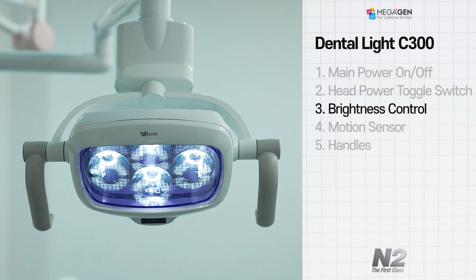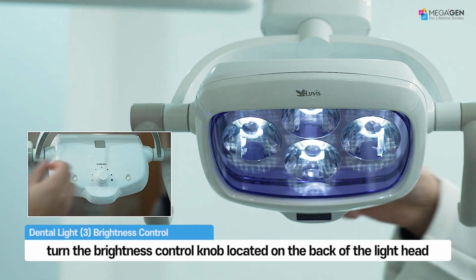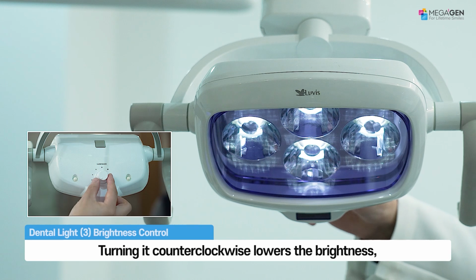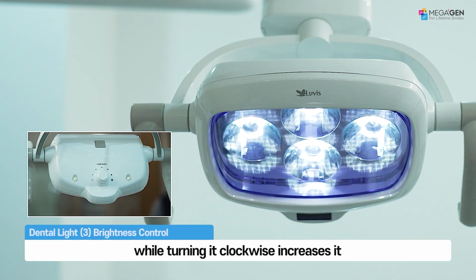Light brightness adjustment function. To adjust the brightness, turn the brightness control knob located on the back of the light head. Turning it counterclockwise lowers the brightness, while turning it clockwise increases it.